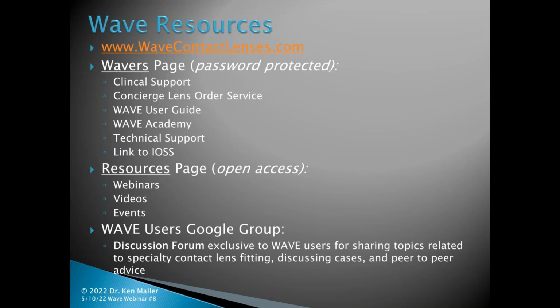Makes perfect sense. For those people without a Pentacam, how do you determine or predict whether the back surface is actually going to be a contraindication for a GP? Good luck. Probably the only tip-off, if you don't have a Pentacam or anything else that can give you rear surface information, is that they have surprisingly good acuity in spectacles or soft lenses, given the fact that the front is very irregular. That would really be the only tip-off.